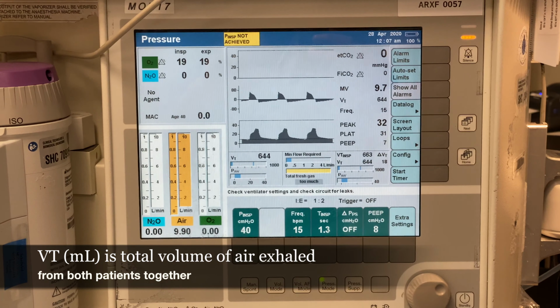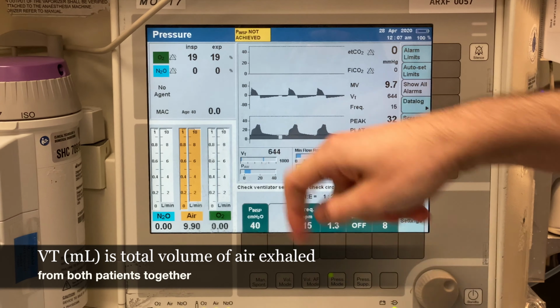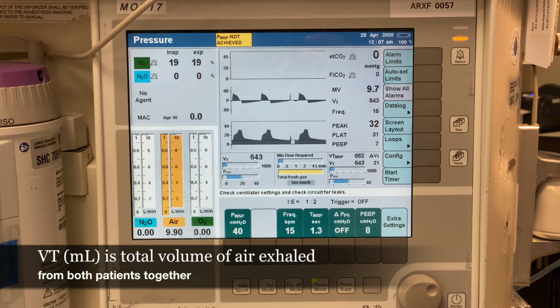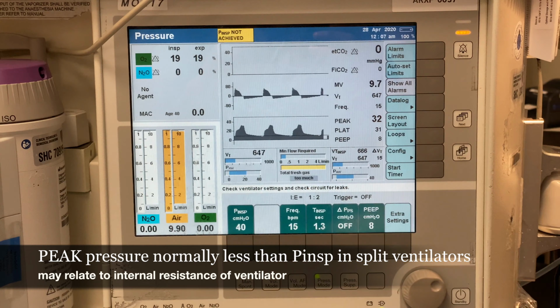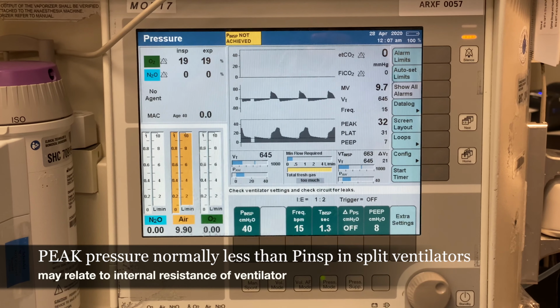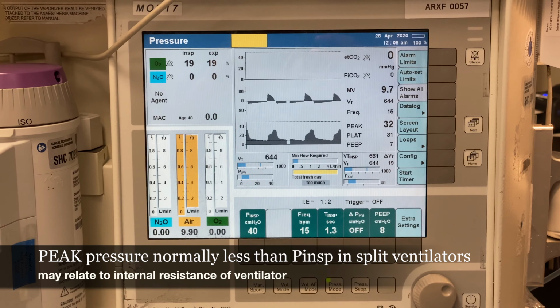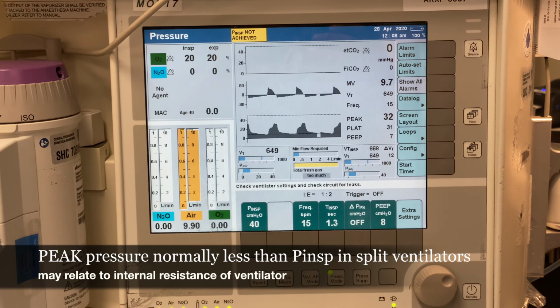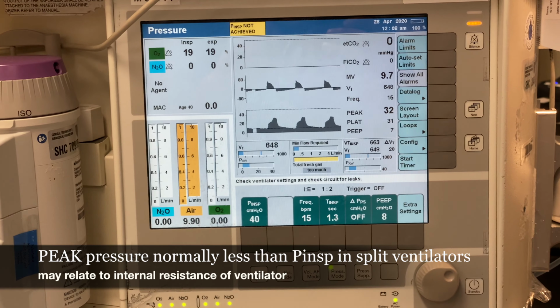You'll notice the feedback that you get from this, we're getting an overall tidal volume, which represents how much we're ventilating the whole system of both patients. And we're also getting a peak pressure back. And if you notice, the peak pressure is lower than the inspiratory pressure that we're setting. And that is actually because this peak pressure will always be equal to the pressure at whichever pressure regulator is set the highest. So this is normal and expected behavior for the design of our circuit.